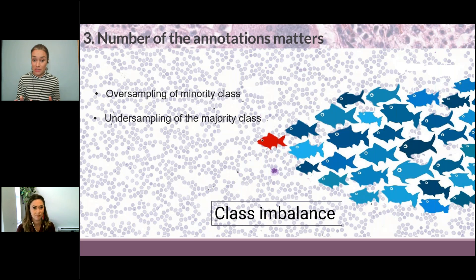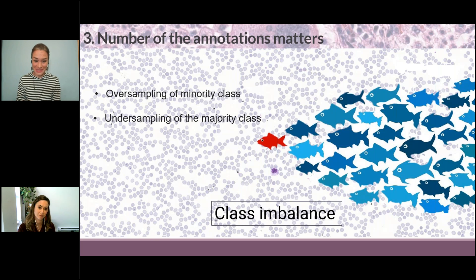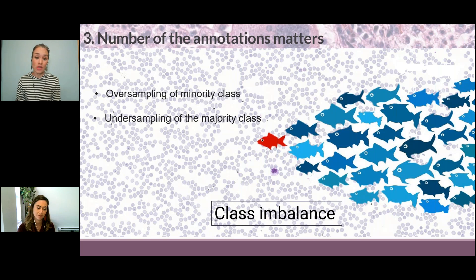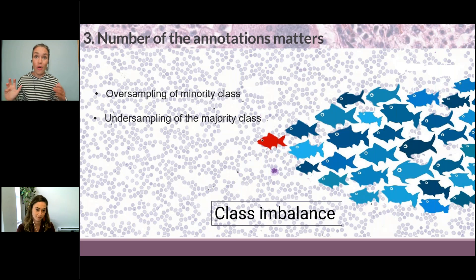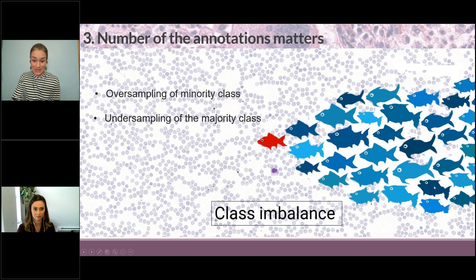And obviously we have to take care to annotate all the appearances of the normals as well, because they don't all look the same, and all the appearances of the abnormal ones too. Basically I do not annotate proportionally to what I see in the image, because the neural network has to see enough examples of all the classes. If we over-provide it with one type of example, it's going to focus more on that.